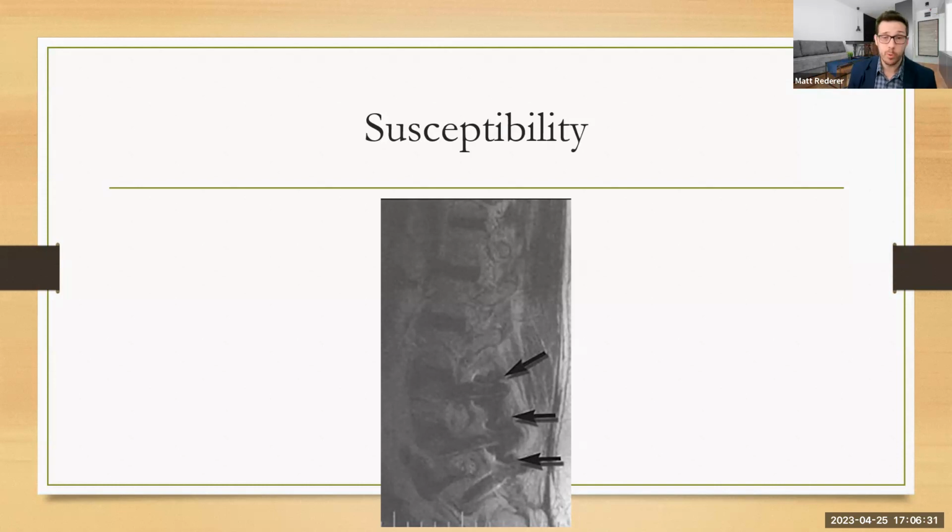There's tricks that we have. One of the tricks is to alter some of our parameters. We can sample a little bit faster. We can also use a technique called the MARS technique, not like the planet. It stands for Metal Artifact Reduction Sequence. So we can use a special sequence to help remove this metal from our image. Right? So it's kind of neat. We just click a button or use a special sequence and we can reduce this artifact, not completely, but significantly. So we have some tricks up our sleeve.